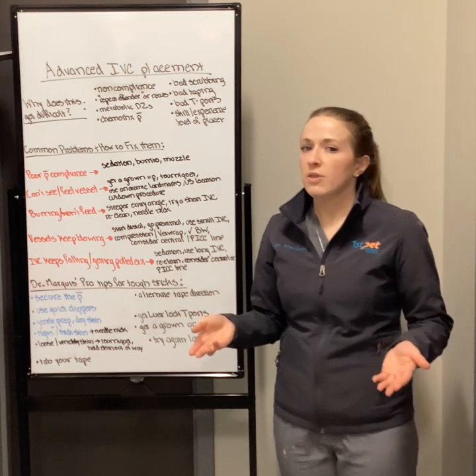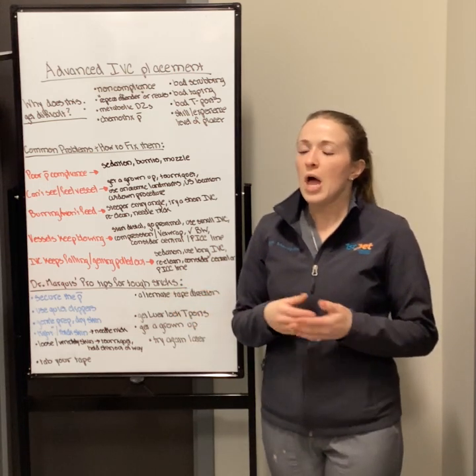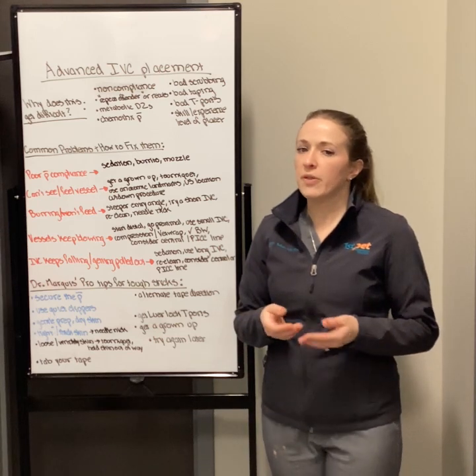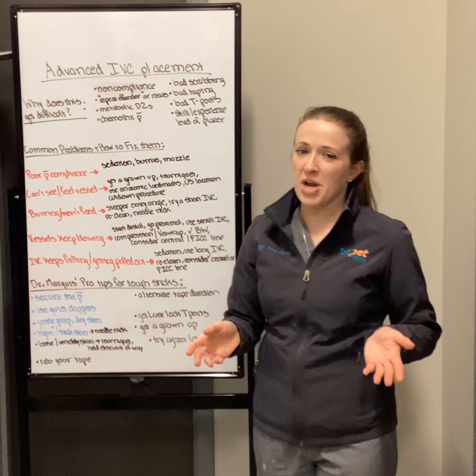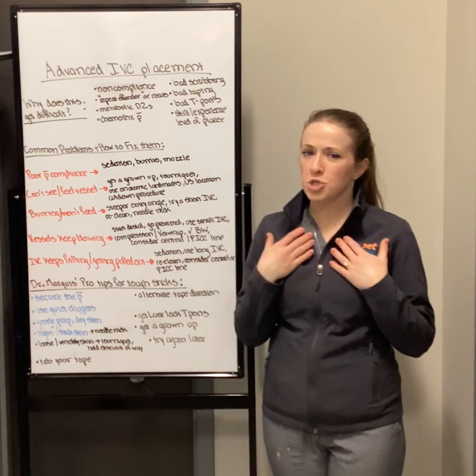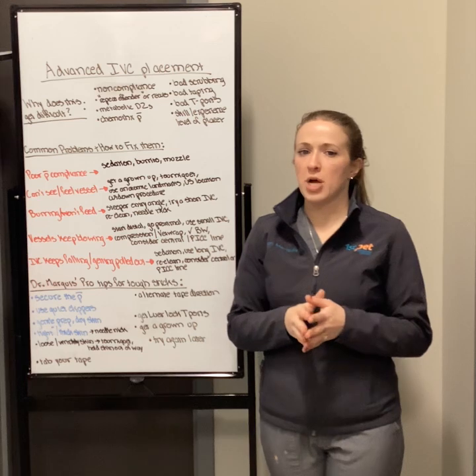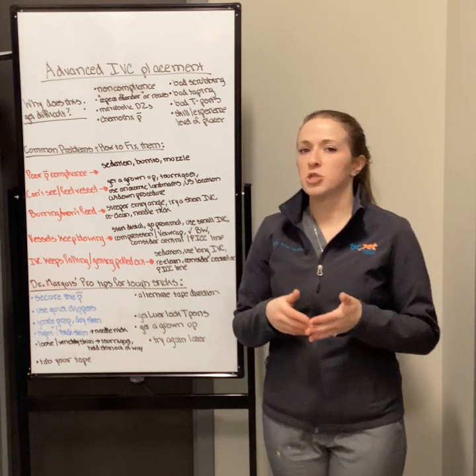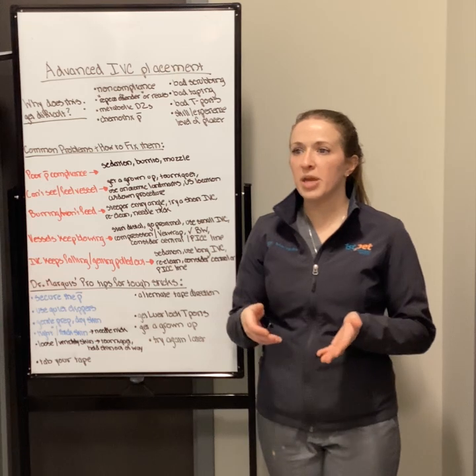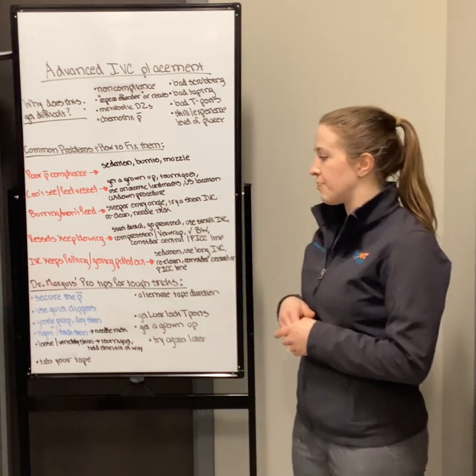Consider a central line or a PICC line. So if you think that all of the peripheral vessels are going to be too tough to hit or they're too fragile, I would strongly recommend placing something like a jug cath, because if you just keep blowing all the legs, you're going to run out of options fast. And maybe it's just your best bet to go for something like an indwelling PICC line or a jug cath. That way it's sutured in, it's bandaged, you have a much more secure way to get blood and sampling. It's going to be there for you for a long time.